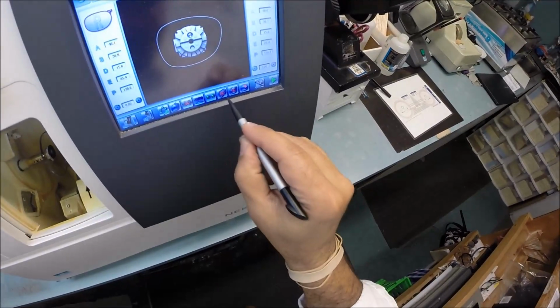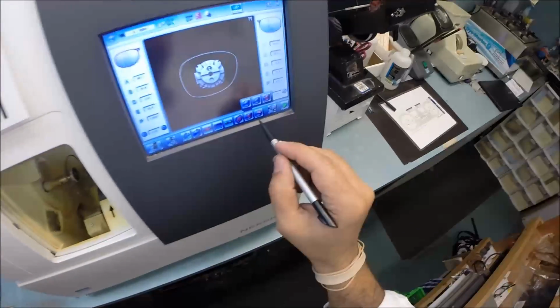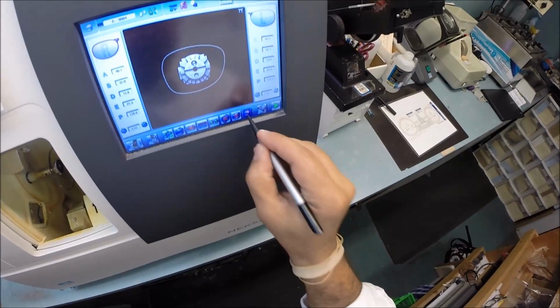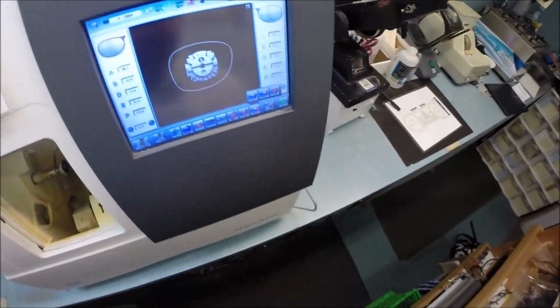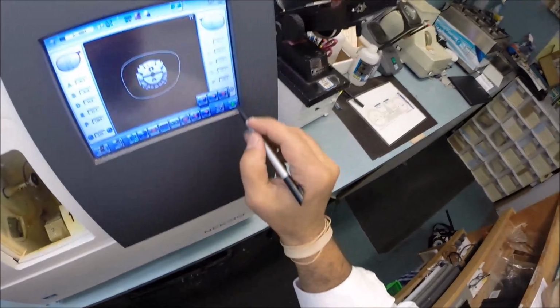I'm not going to polish the edge of your lens because it's not going to be seen anyway. I'm not going to put a bevel on the front convex surface of your lens. I'm only going to put a bevel on the rear concave surface of the lens. And that concludes your vocabulary lesson of the day.